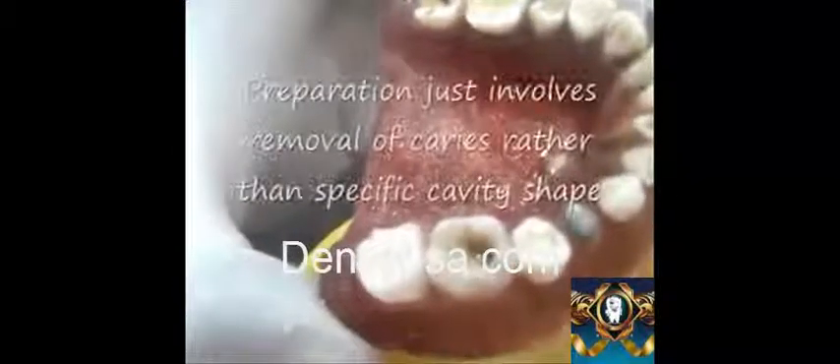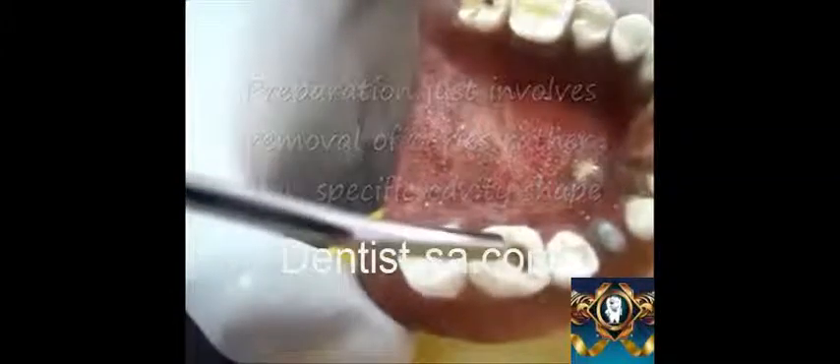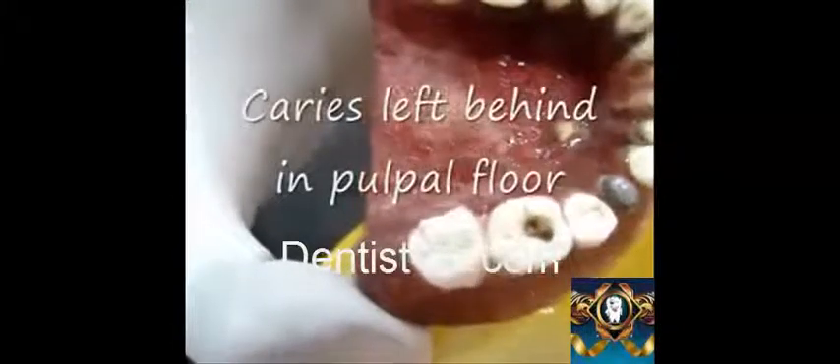Once the preparation has been done or finished, it is dried with a three-way syringe to evaluate the preparation. As you can see in the pulpal floor, some amount of caries has been left behind so that the pulpal exposure doesn't occur.